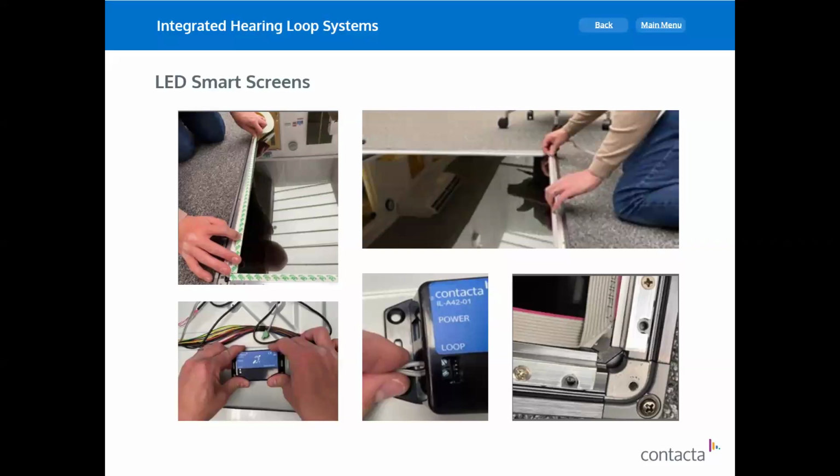This project was all about finding the right location for the loop first, testing it, and then the rest was pretty easy, because the rest was just the integration of the small driver, connecting the loop to it, and then powering it up from the internal connector in the screen and then feeding the audio from one of the speakers, literally. So that was an interesting product.